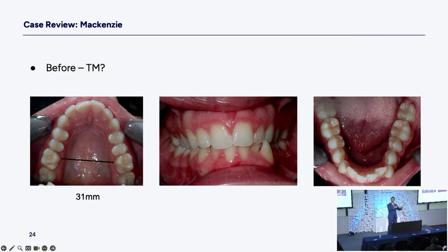If you don't measure it, when you send it in for your treatment plan, guess what? When you open up your treatment plan, there's a grid. You can hit the grid button and put it on the screen and measure it then. So you have a fail-safe, even if you never measured it in the office, you have it on the grid. We're going to open one later to show you what it maps out to be.